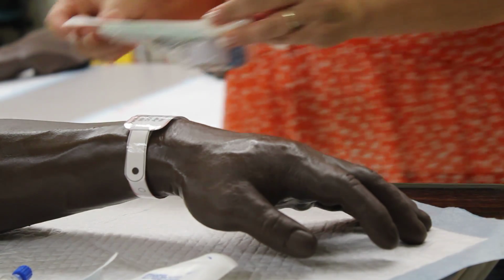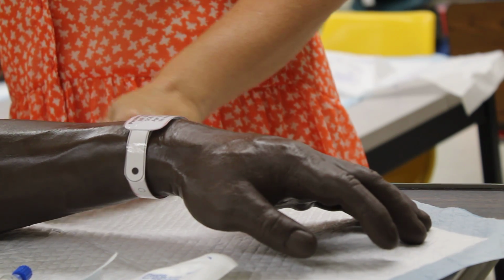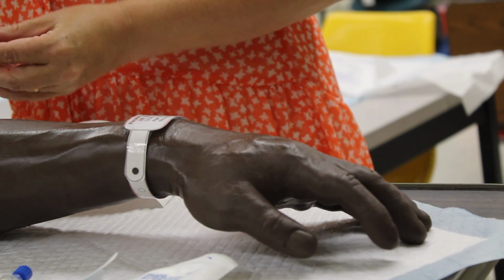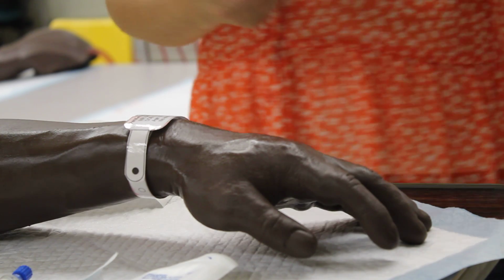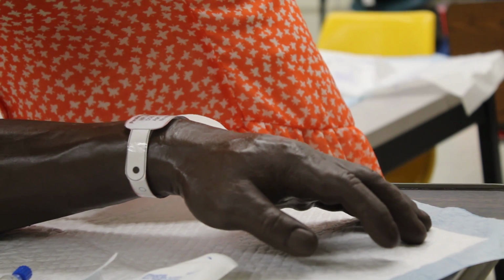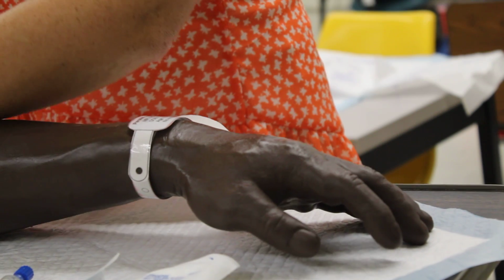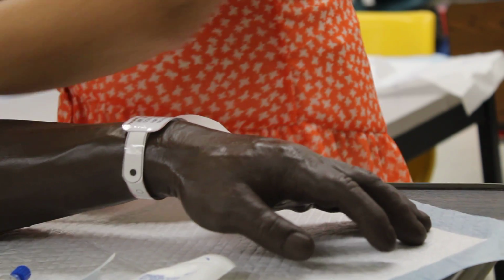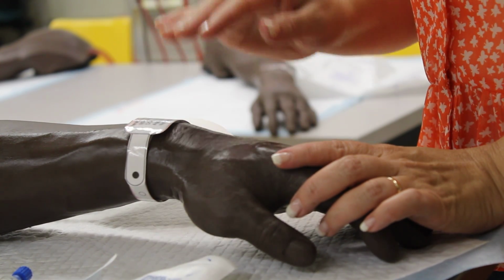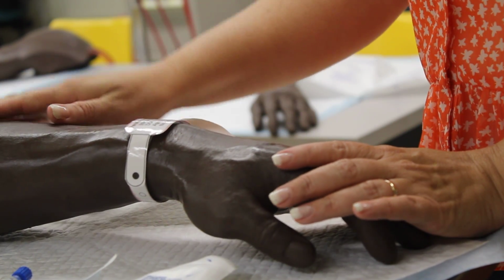So first thing you're going to do, once you have done all of that, is go into the room and see if you can find a vein that you want to use to start your IV on. You'll pull out the tourniquet and you'll place your tourniquet. You can refer to the other video on tourniquet placement for how to actually put a tourniquet on properly. So I'm going to put my tourniquet on, allow the time for the veins to engorge. I will check for veins that look good. I want to start my IV as distally as possible first and then work my way up the arm.